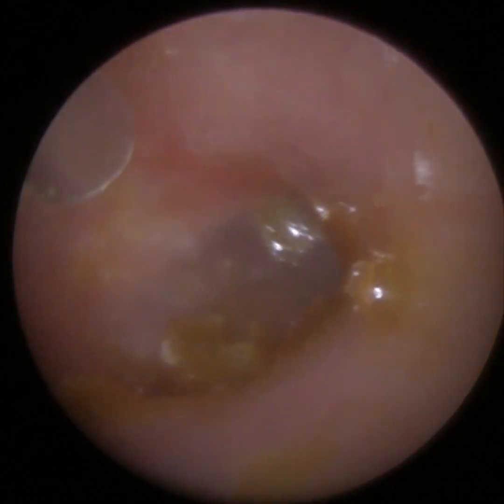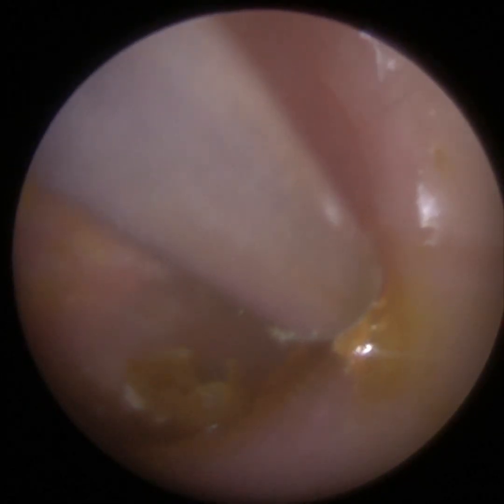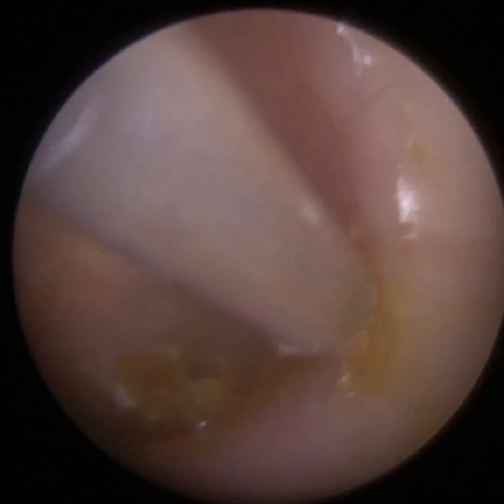So you can see this, the eardrum's visible, but we've got this skin, and okay, we could have left it, the patient was hearing better, but the skin's not going to come out by itself. So I just wanted to try and get this out for the patient.